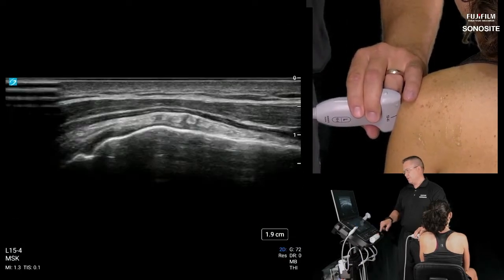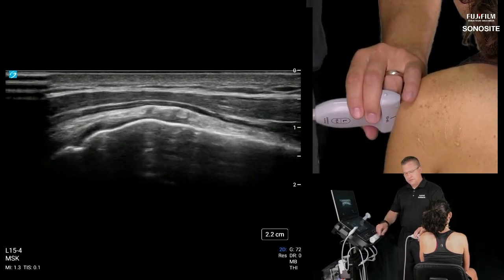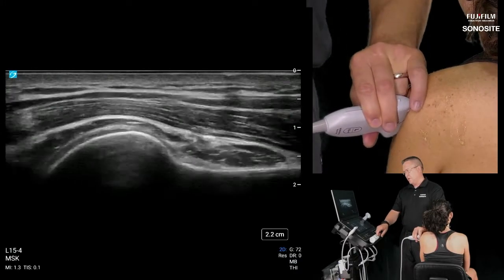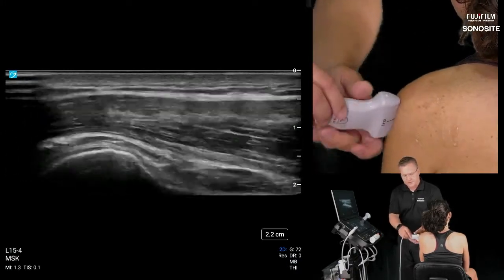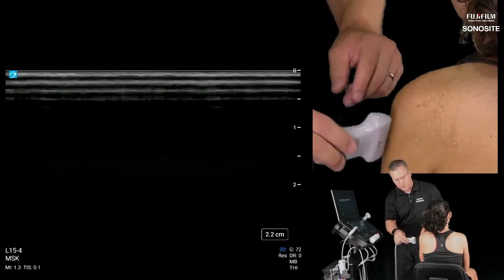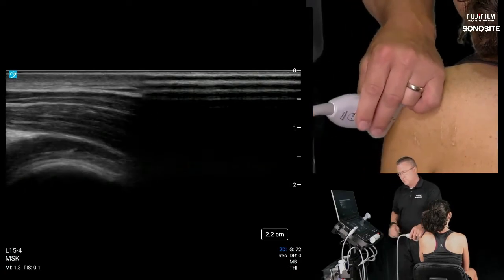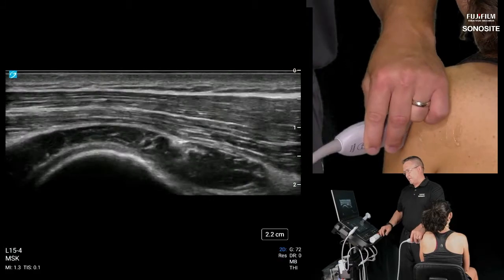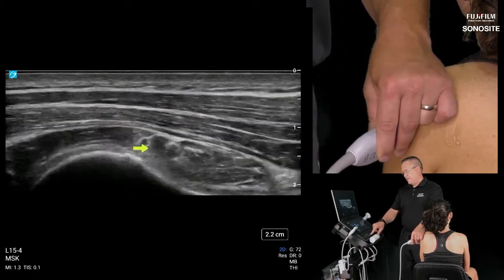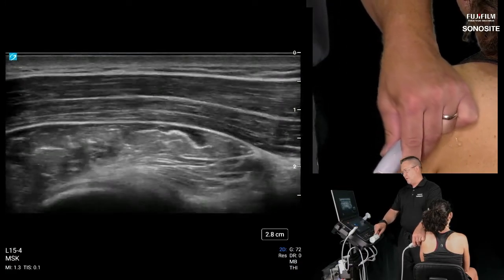So I'm going to unzoom. I'm going to back out. Now let's follow proximally until we see another bony landmark. Remember, I'm scanning the surface of a cylinder in this case instead of a round ball. And as I go posteriorly, I have to aim back into the cylinder, right? So that's the scanning technique I'm applying here. Still following this muscle belly. Make sure it stays 90 degrees to your beam. It's nice and bright the whole time.